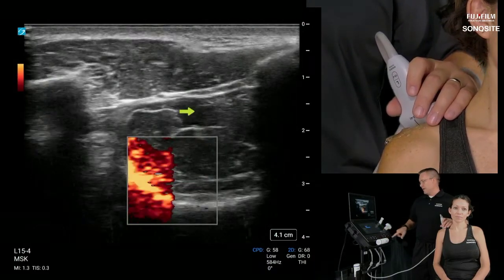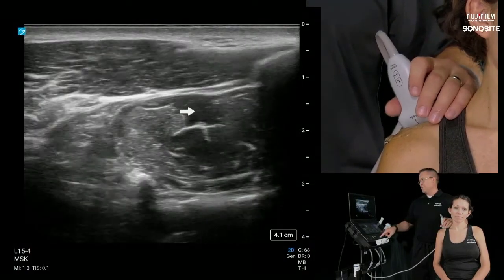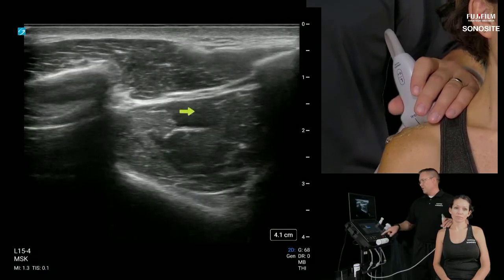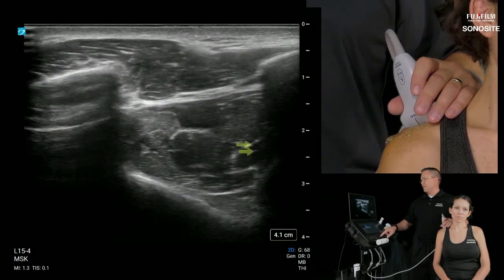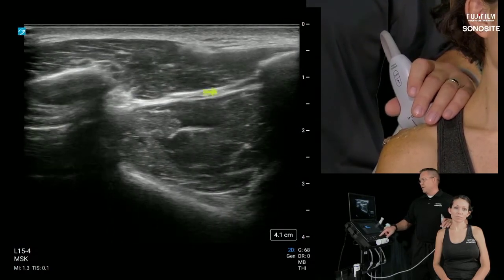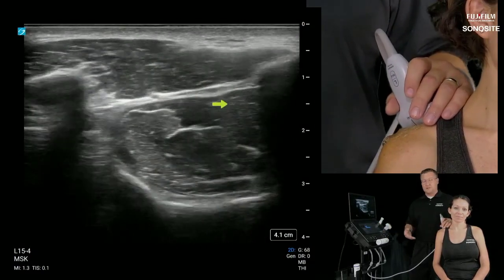deep there. Diagnostically, if you're doing an exam on the supraspinatus, as we covered in the lateral shoulder and posterior shoulder, I think we briefly touched on it, this muscle should be nice and dark all throughout, all the way up to that fascial plane. You shouldn't see a dirty shadow or rim around the muscle belly. It should be nice and dark right up to the fascia. So that really concludes the majority of what we do when we're looking at a superior shoulder exam, plus a little extra.